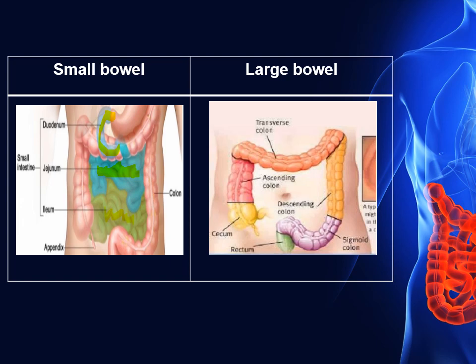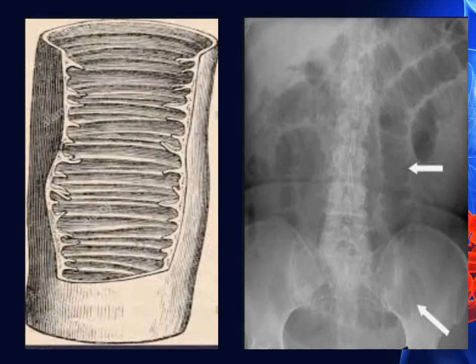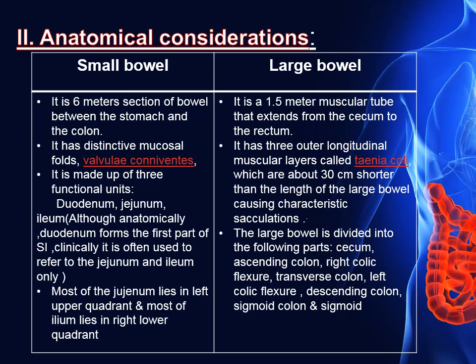As you can see here, the jejunum, marked by the blue line, occupies the upper part of the abdomen and is inclined more to the left side, while the ileum, highlighted by the green line, is located in the lower part of the abdomen and inclined more to the right side. The small bowel has a characteristic appearance secondary to the mucosal folds called valvulae conniventes.